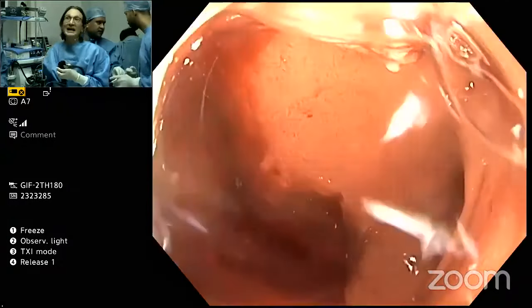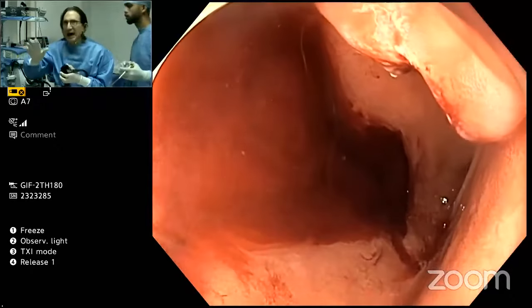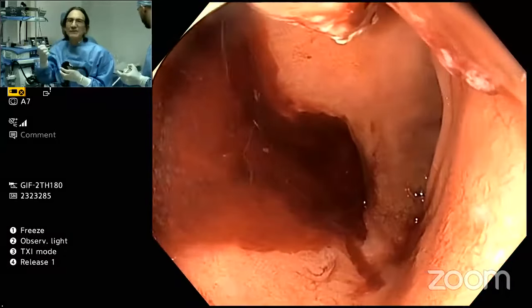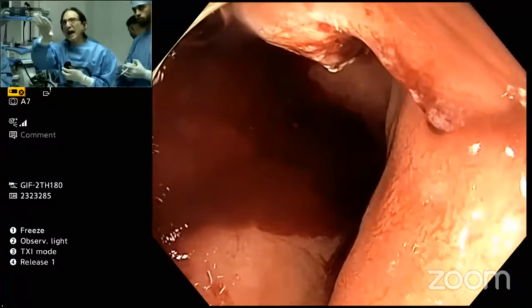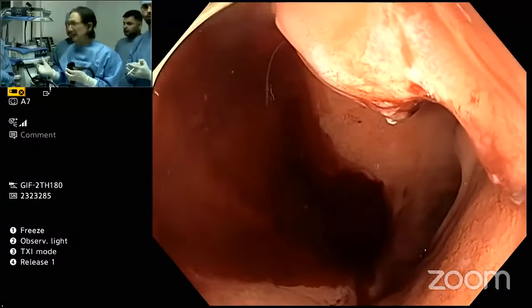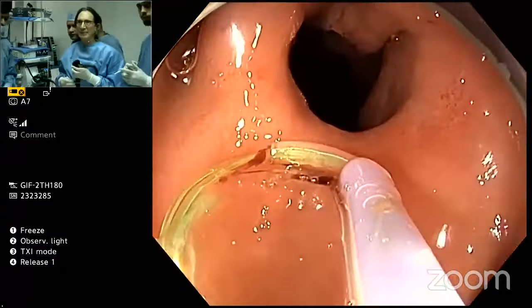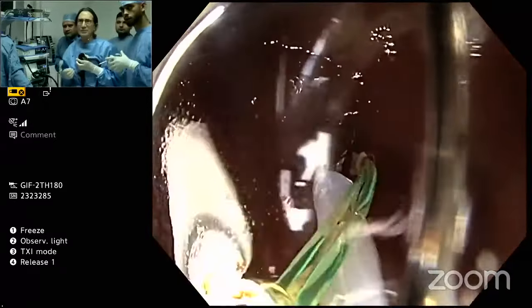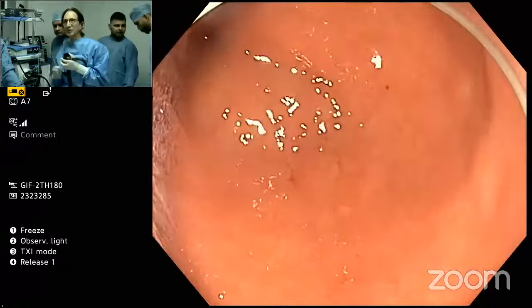That's all. Okay. That's why, if the loop had worked and the loop were still in place, we'd be done. Right? We'd be done now, because the loop is protecting against the bleeding. But since I wasn't able to give traction and get the loop flush up against the wall, I unfortunately don't have the loop now protecting against future bleeding. So let's see, what's this here now? Okay. Let me get rid of this. I'm sorry, just open up. I have to get rid of this. Forgot about this one. Actually, I could maybe pull this out. Yeah, there we go. Okay, good.